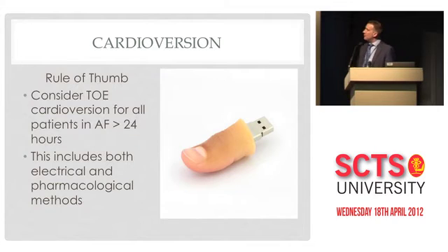My rule of thumb for cardioversion would be to consider a TOE cardioversion for all patients in AF more than 24 hours. We have TOE readily available in theatres and intensive care. We're all very practiced in using sedation to do TOE.